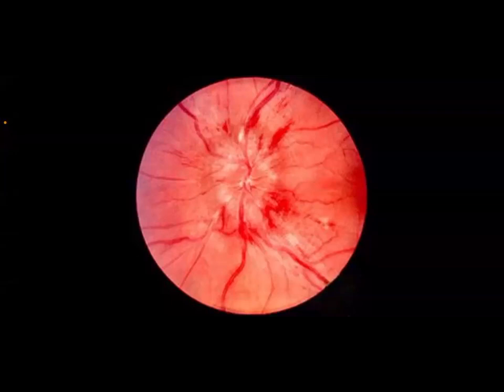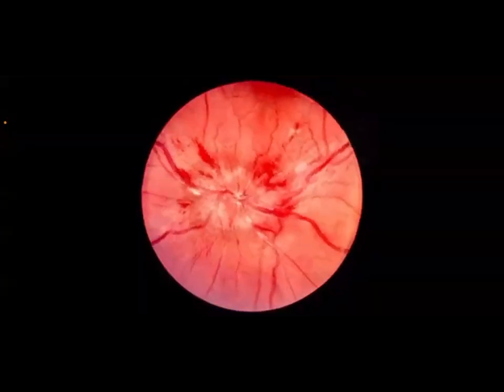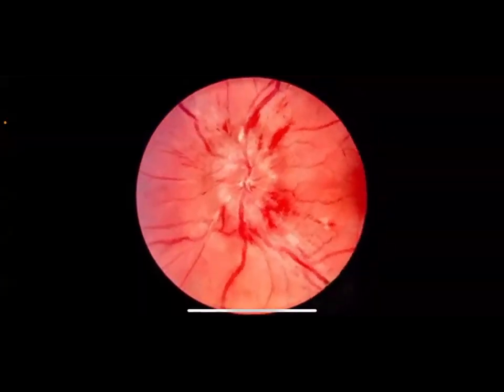So till now we have got two diagnoses. We landed on the retinal artery. We followed the V shape or arrow shape, the bifurcation of the retinal vasculature, pointing to the optic disc. We reached the optic disc and examined it. Either it is normal or we have optic atrophy or papilledema. So by now we have two possible diagnoses, which you can find in the PACES.